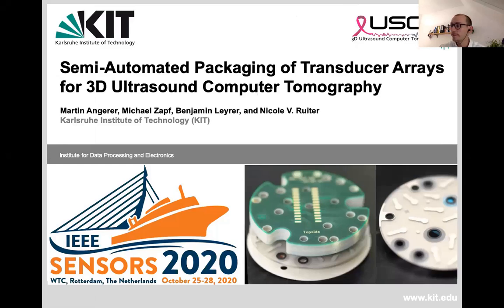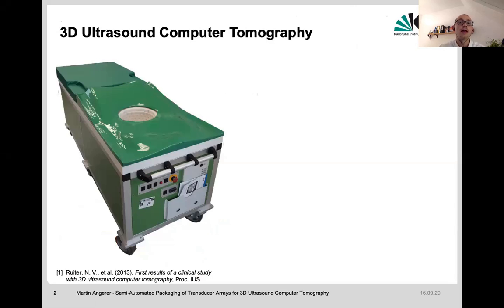In the next few minutes, I want to present to you a semi-automated packaging of transducer arrays for 3D ultrasound computer tomography. So what is 3D ultrasound computer tomography? It's a tomographic imaging approach based on ultrasound. Here you see our second generation prototype device for breast cancer screening.